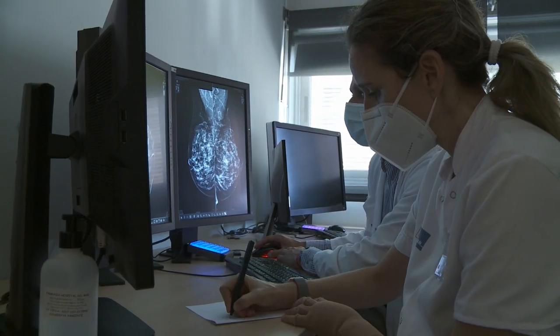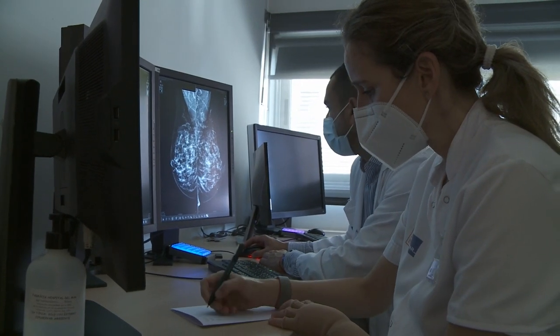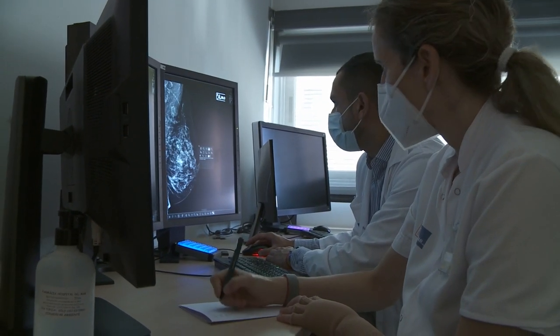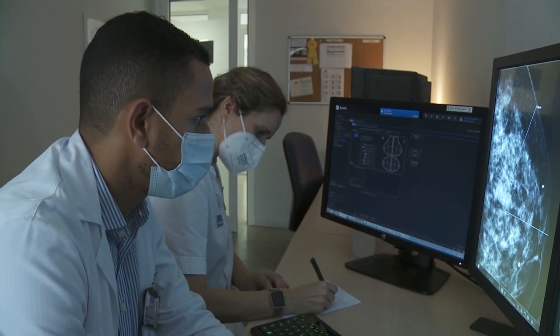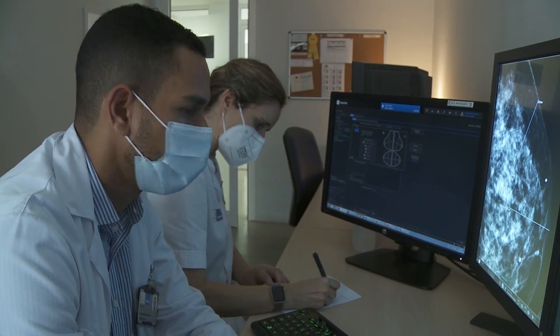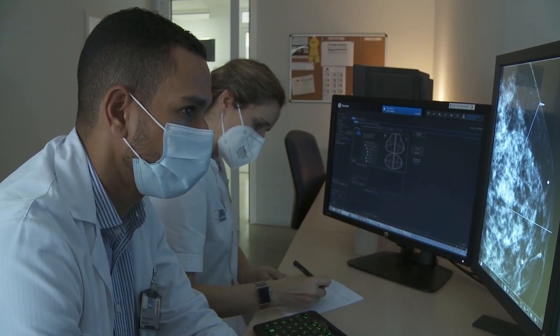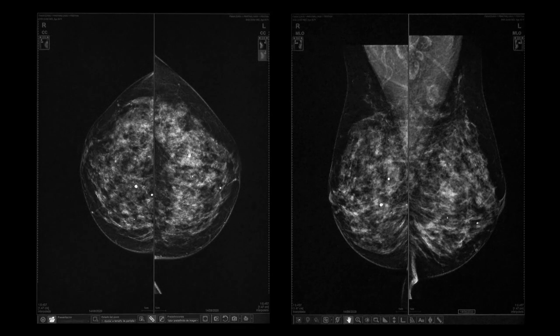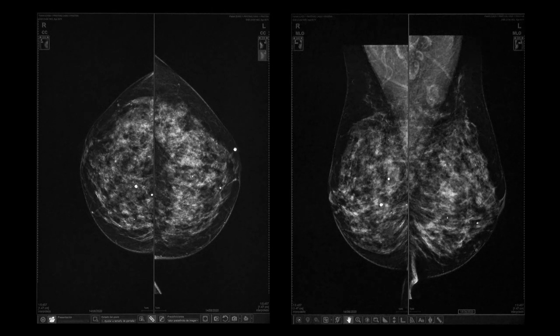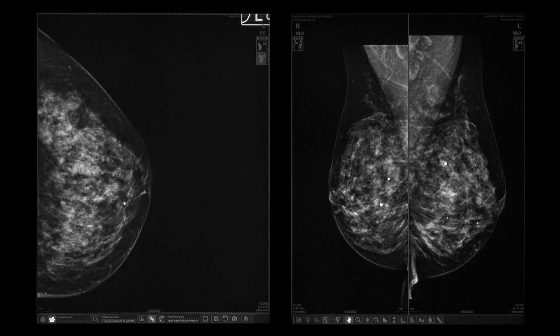The access route with the shortest distance from the skin makes it as comfortable as possible for the patient. This will facilitate targeting, optimize timing, and therefore increase success rates.